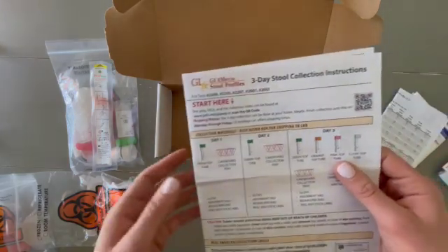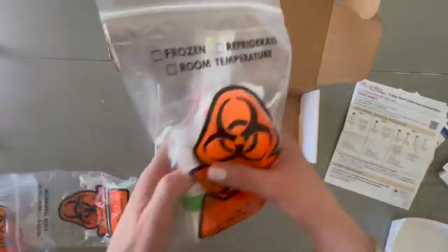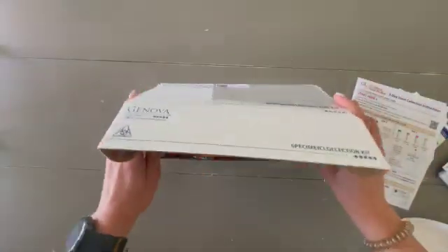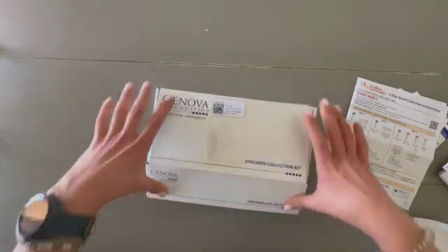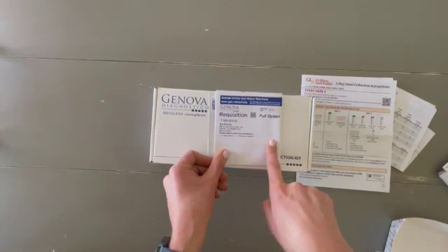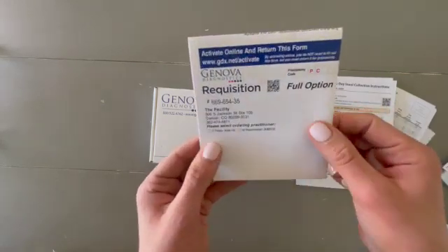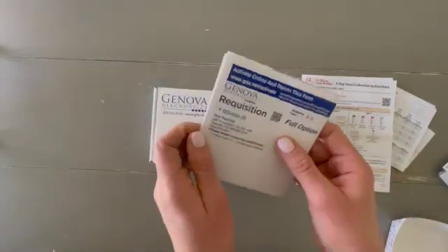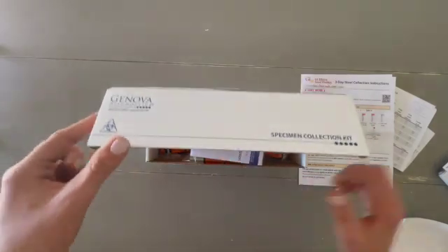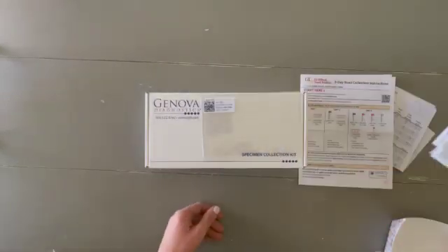Once you have collected all three samples over all three days, you will put everything back into the box — it should fit nicely, there's plenty of extra room. Seal it up and make sure the requisition form is included. Just make sure your name is on there somewhere in case anything gets separated. They do use the tracking number on it, so it's not the worst thing if it's blank, but it's a good idea to have your name on it. Then put it into the shipping label, drop it in the FedEx box, and you're good to go.